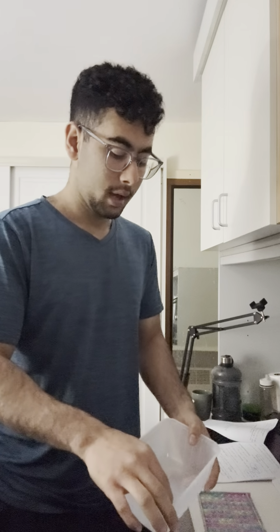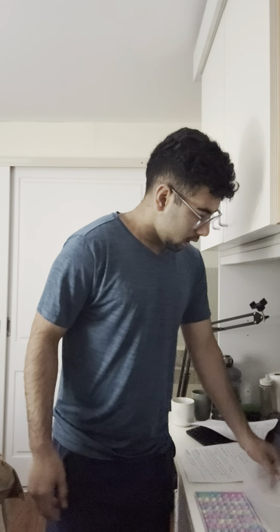How you know how much you are giving is based on the chart as well, and you need to write it down in the blue line: how much you give, your initials, and the date when you gave it. So once that's done, I reckon I do have the insulin syringe here.